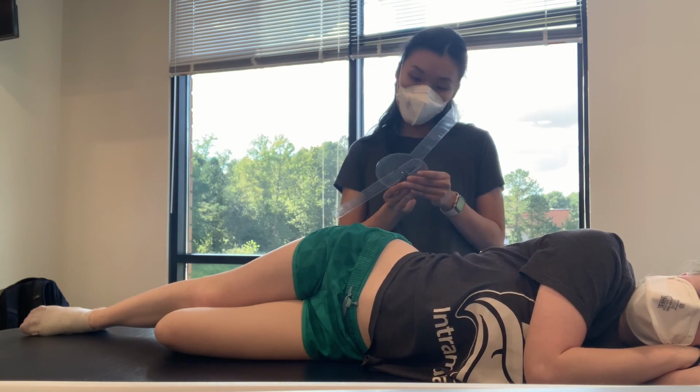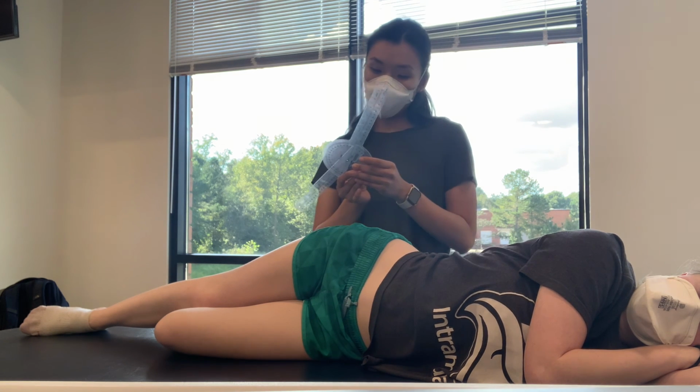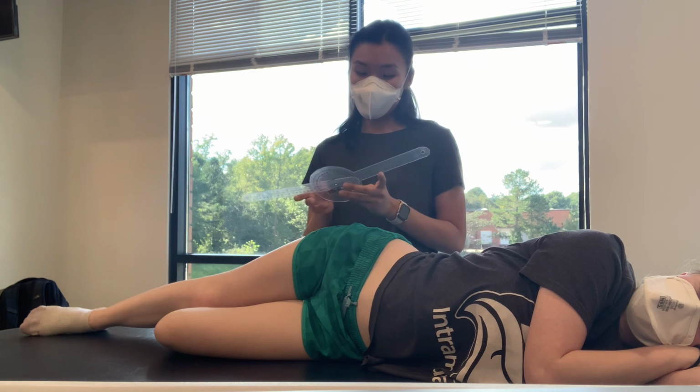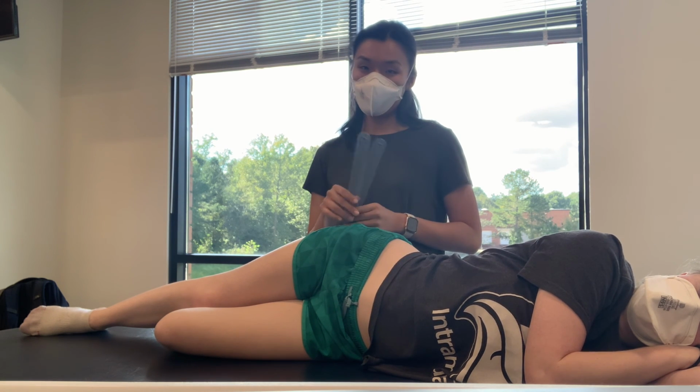So I have 15 degrees. So Katie is a little bit below normal, but she's still okay.